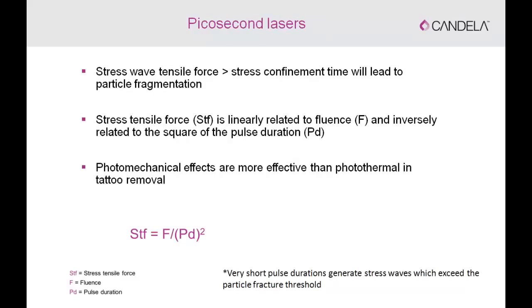But for the same fluence, if you shorten the pulse duration, you would have a much higher stress tensile force that will then exceed stress confinement time, and that leads to particle fragmentation. And this is why with the short pulse durations of the picosecond lasers, we have much more of a photoacoustic or photomechanical effect, therefore much more shattering effect with less photothermal effect, which again means higher efficacy as well as safety and less pain and discomfort to the patient.